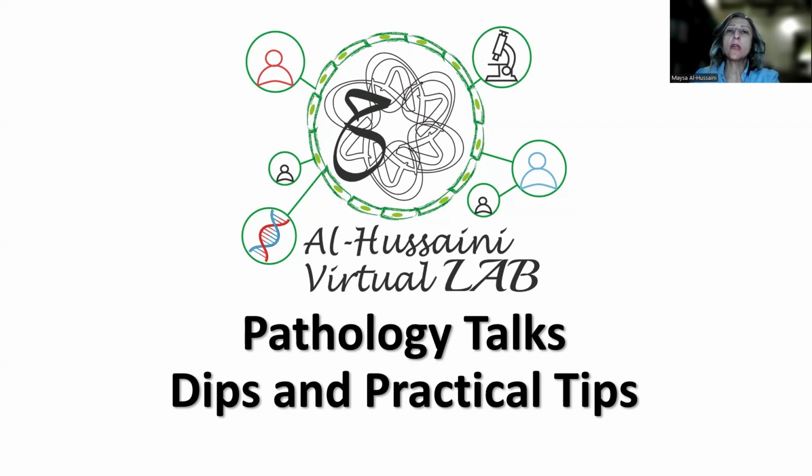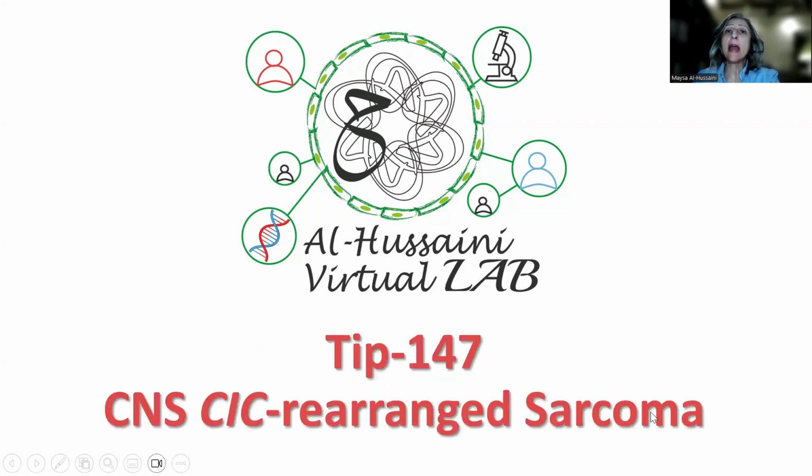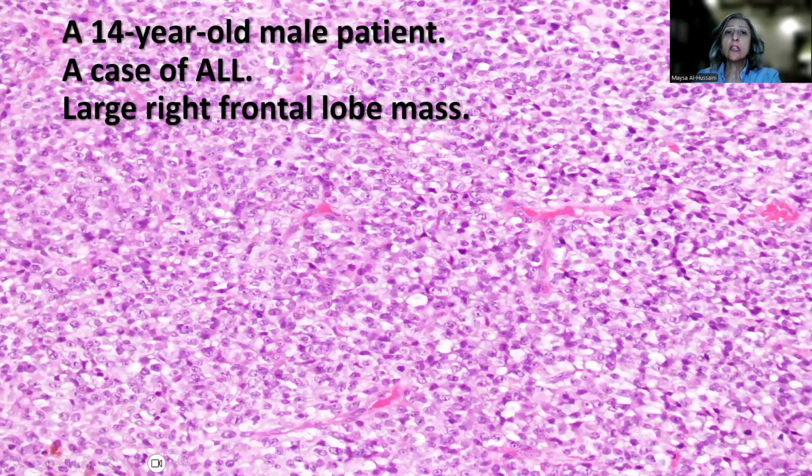What I'm going to be sharing with you today is a nice example of a rare and recently described tumor, which is the CNS CIC-rearranged sarcoma. So this is a case of a 14-year-old male patient who was diagnosed a few years back as ALL, for which he was treated and cured. He presented with a large right frontal lobe mass that was completely excised.